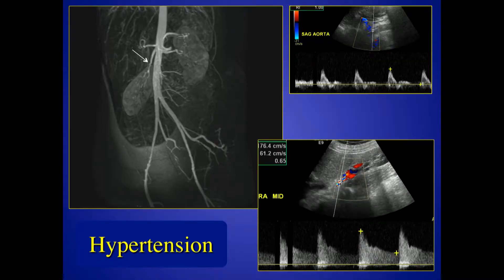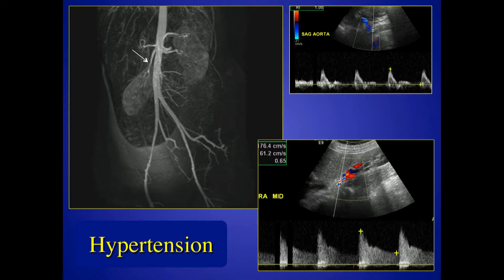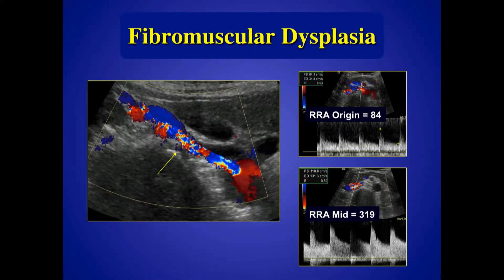Here's a patient with FMD. We see it on the MRA involving the iliacs — you can see the beaded appearance. We also had FMD in the renal artery. FMD occurs in younger patients and in the mid and distal portions of the artery, unlike atherosclerosis which likes the origin. So when you have a younger patient with hypertension and you want to evaluate for renal vascular disease, you need to make sure you see the whole artery really well. Here's another example of FMD with elevated velocities at the mid-portion of the vessel.